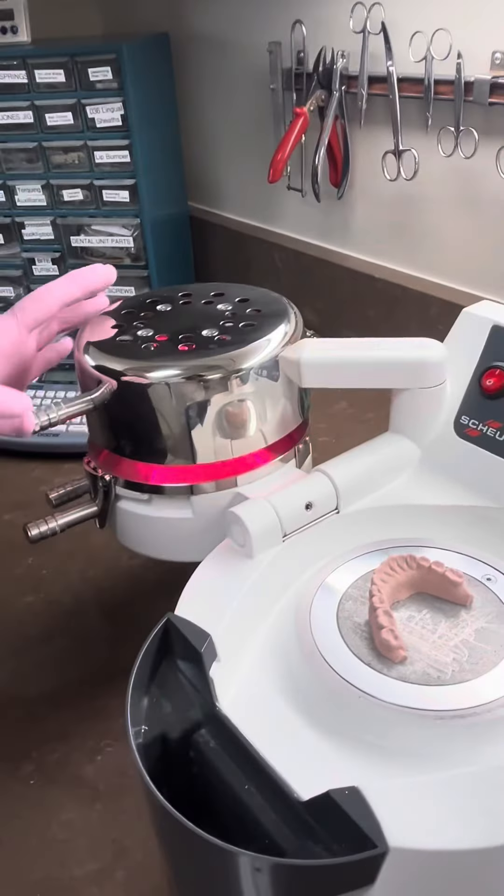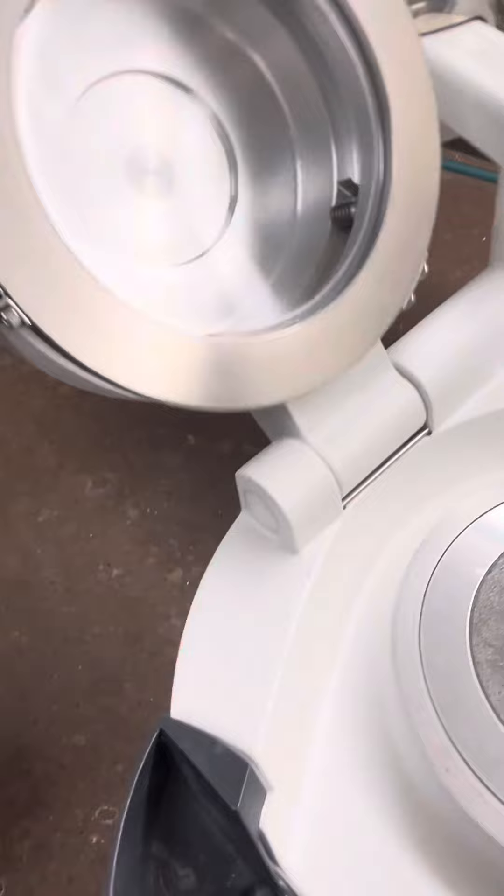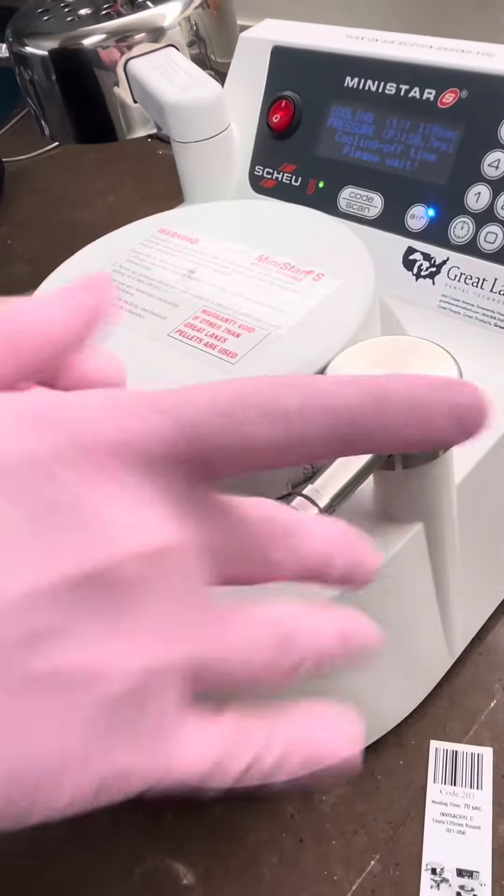So you can see the plastic — see how it's sagging? Flip it. This is the first shot.